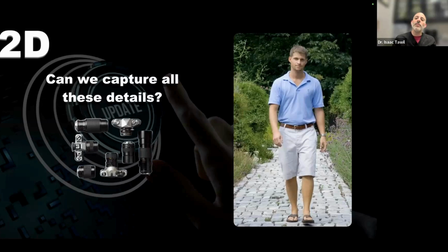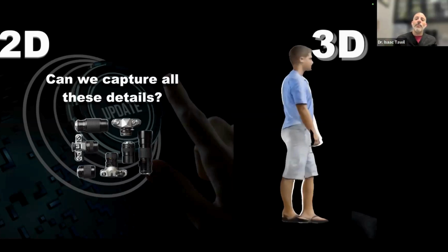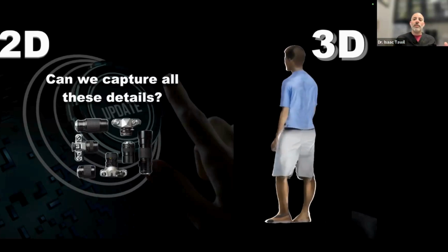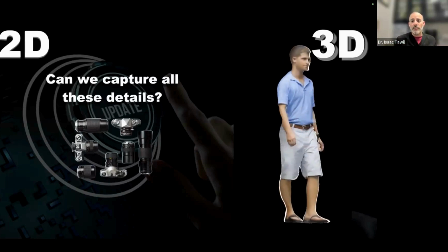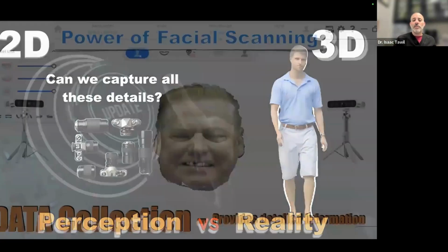Since we don't live in a two-dimensional world, photographs can only get us so far. When we now step into the three-dimensional world, we can truly digitize our patient. If I'm a laboratory technician and you give me a two-dimensional or a three-dimensional picture, I can see so much more from the three-dimensional picture just with my eyes. So that becomes more of a perception versus reality thing. We may think the patient is smiling fully, but maybe we're not capturing it. It's great to be able to do a real, true analysis for that patient.